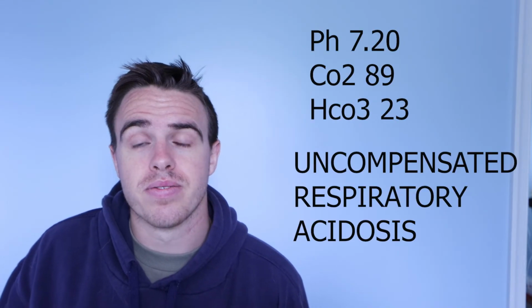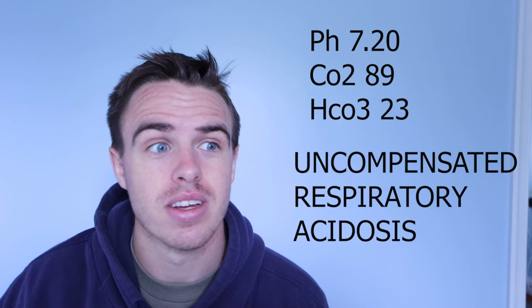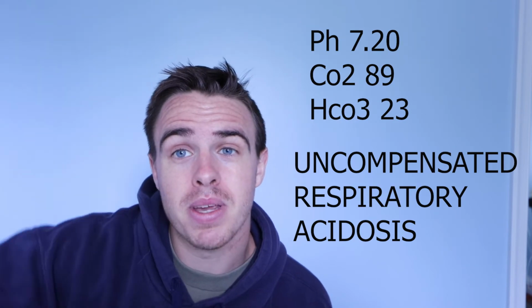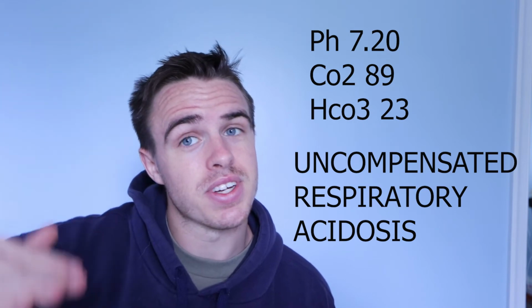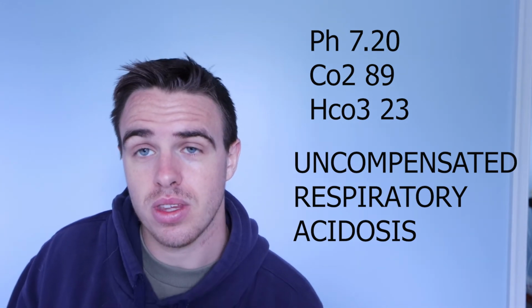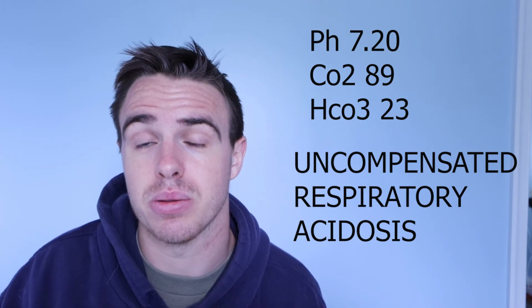So how about this one here? We can see the pH is obviously low, CO2 is very high, bicarb is normal. So we can see what that CO2 is doing. We can see that the CO2 is dropping that pH really low. So when the CO2 is high, it's going to bring the pH very low. And then the bicarb is not doing anything, it's kind of just where it's supposed to be. So I apologize I didn't talk about this for the last few, however this one here would just be a respiratory acidosis.